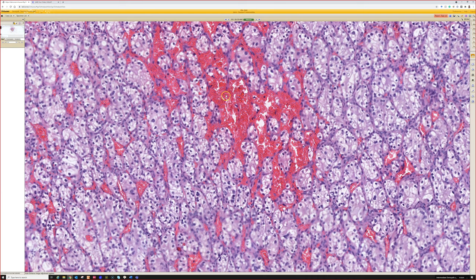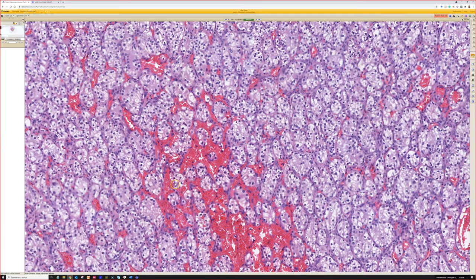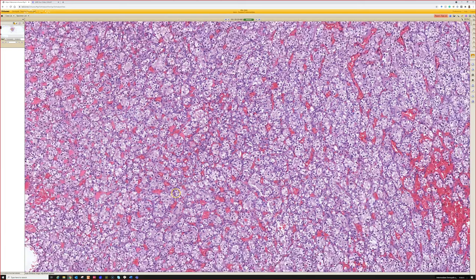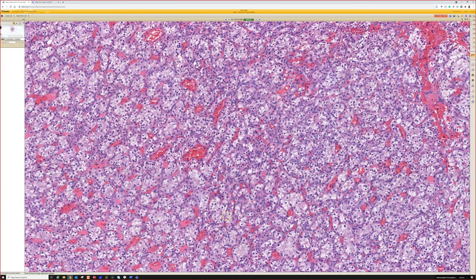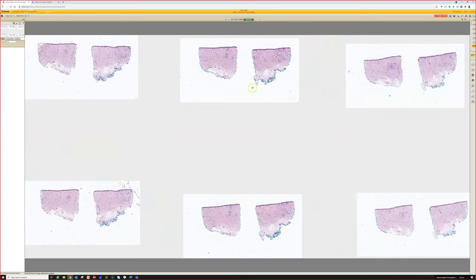And then in between the nests, you have these anastomosing blood-filled vascular channels. So that's a very characteristic thing, not just the clear cells, but that vascular network is very, very characteristic of renal cell carcinoma. They're very bloody metastases, and they do metastasize to the skin relatively often. Often I feel like I see them most on the scalp, but they can really be at any site. PAX8 would be a marker that would stain these, and there are a variety of other markers for renal cell carcinomas. History, of course, is important there, or getting scans.